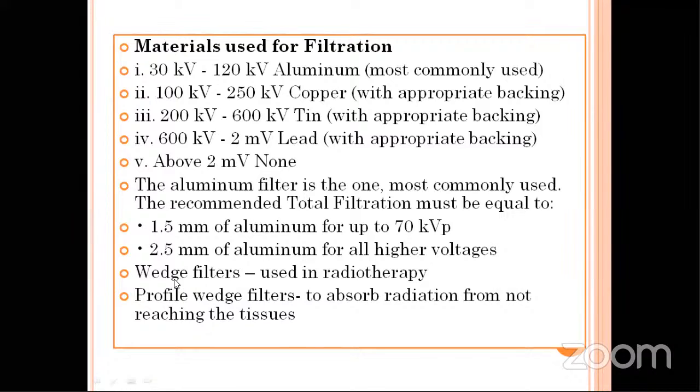Okay, and the wedge filters are used in radiotherapy. So you may get a question like, which type of filters are used in radiotherapy? So we have seen total, inherent, added, now wedge. Wedge filters are used in radiotherapy. Therapy is something where you use it for the treatment of cancers.